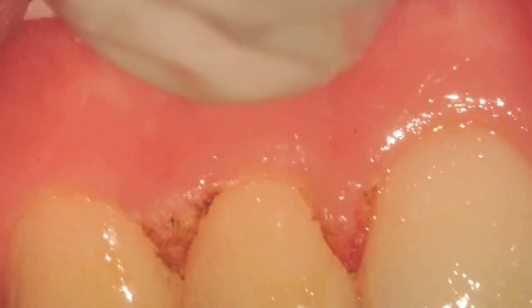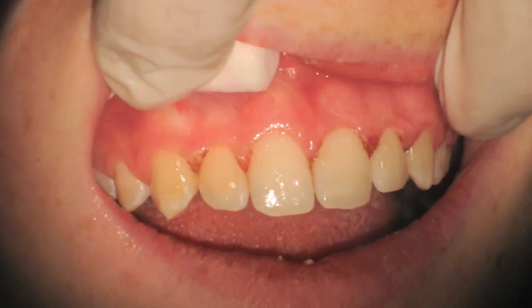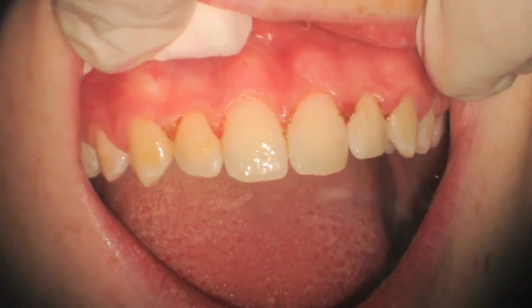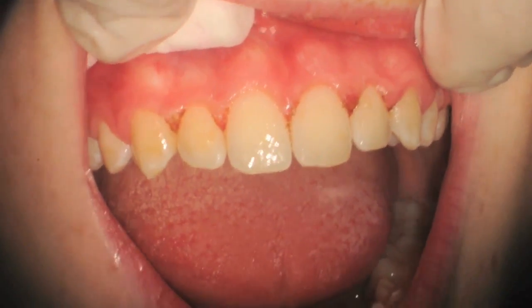We can see a clear view at high mag of what we've accomplished. Here we are at low mag after completing all six upper anterior teeth — you can see what a nice result we've been able to obtain, again without any injections.